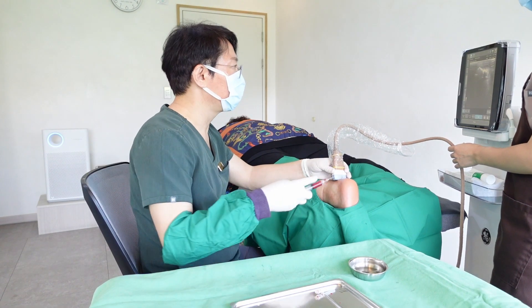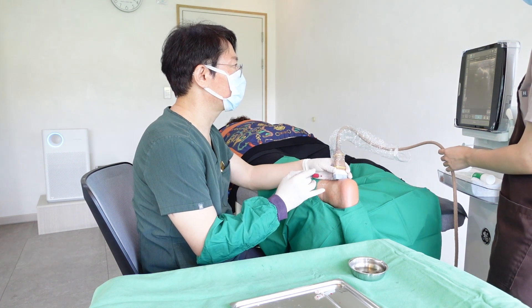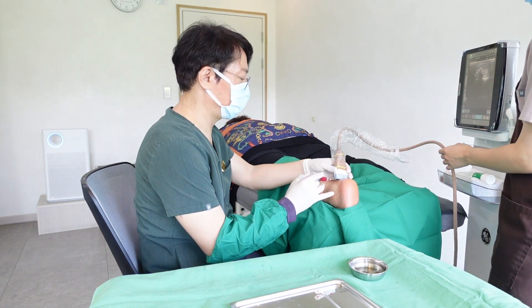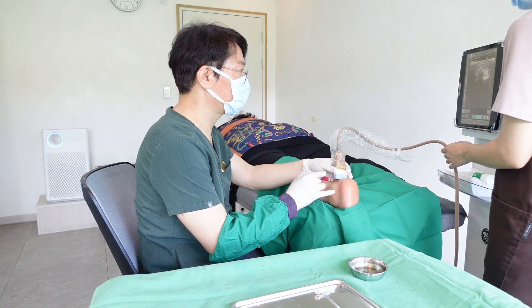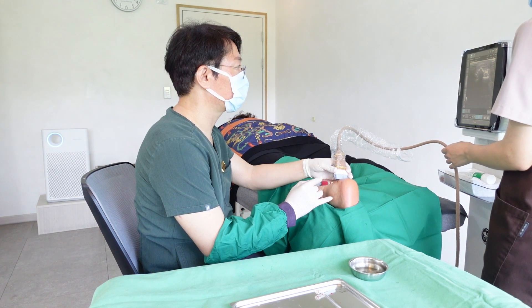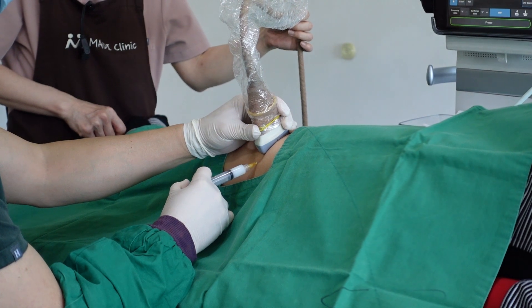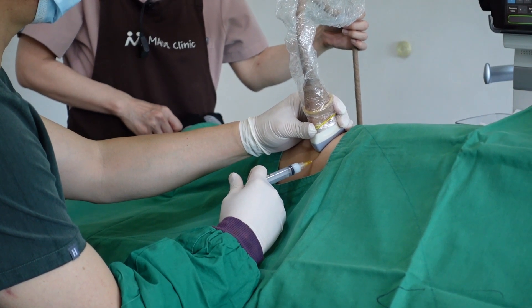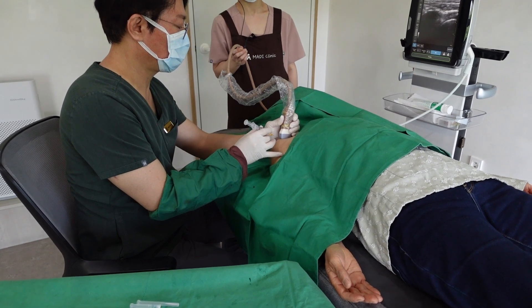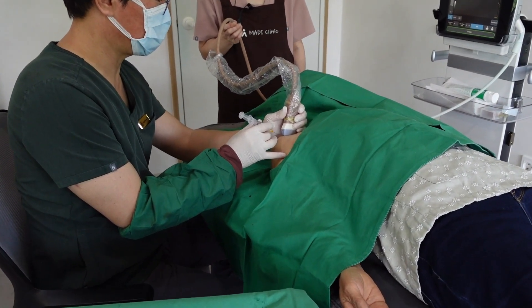Probe pressure: apply gentle, even pressure on the probe for good contact with the skin, which will prevent patient discomfort and image distortion. With a stable base established, apply gentle pressure to the patient's skin and glide the probe over the area of interest. The hypothenar region or wrist will act as a support to maintain steadiness and control as you move the probe.